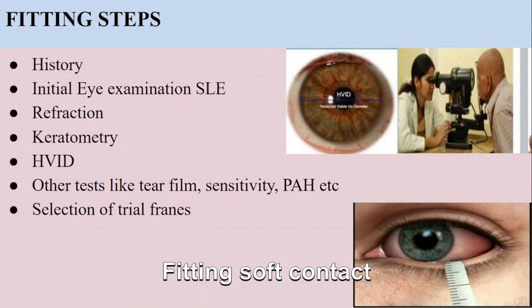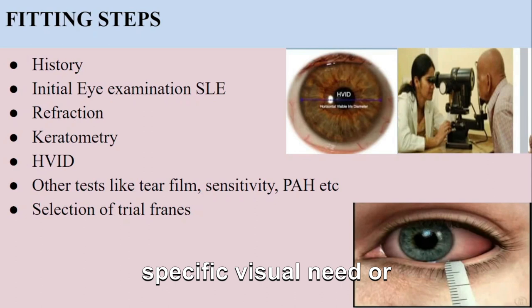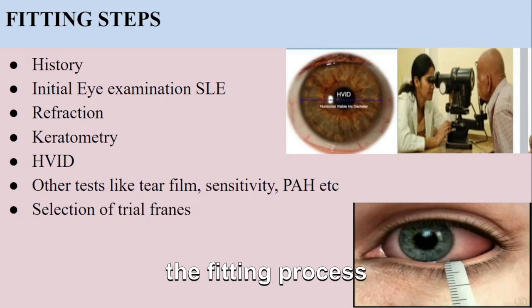Fitting steps. Fitting of contact lenses involves a series of steps to ensure a comfortable, precise fit for each individual. Let's take a look at the main steps involved. History. The first step is to gather information about your eye health history and any previous contact lens wear and any specific visual needs or concerns you may have. This helps the eye care professional understand your unique requirements and tailor the fitting process accordingly.